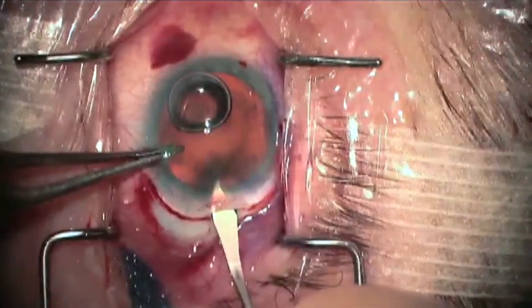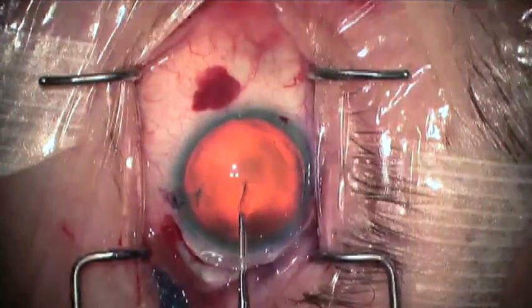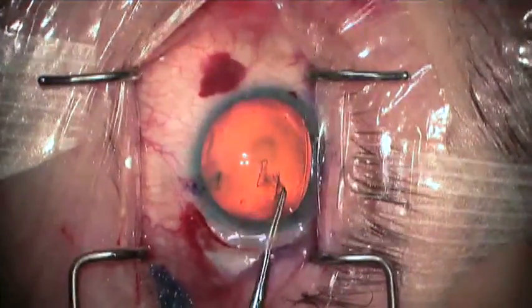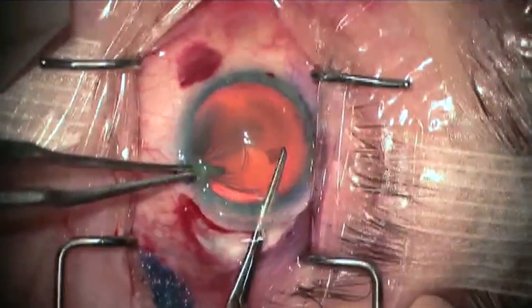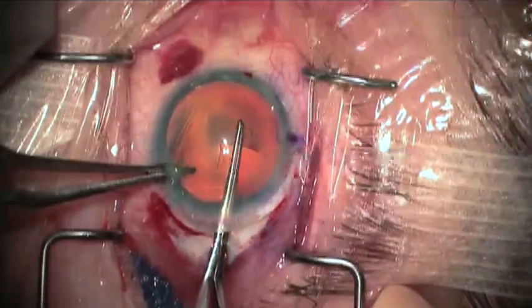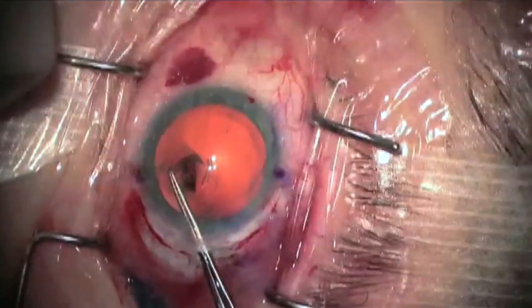A 2.2 millimeter keratome is used under the flap, and then a capsulorexis is fashioned with forceps. Care is taken to generate a capsulorexis between 6 and 6.5 millimeters in diameter. If the capsulorexis is too small, it will be difficult to implant the telescopic device in the capsule bag.